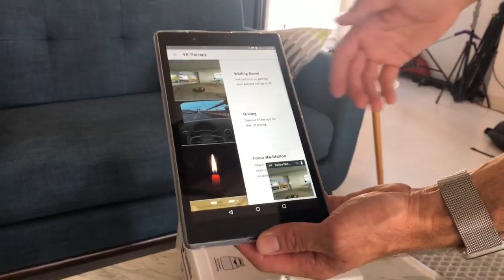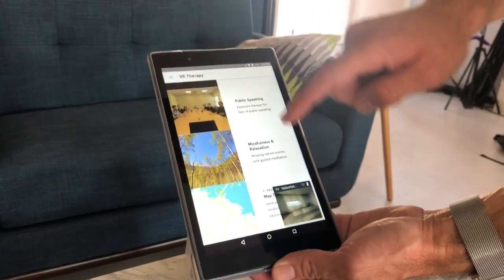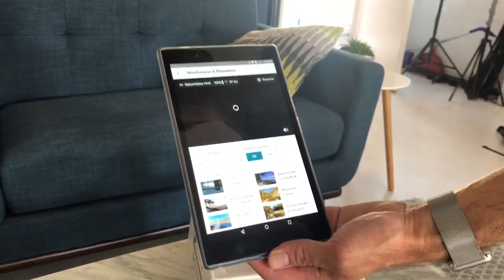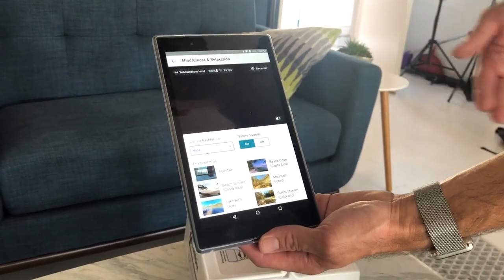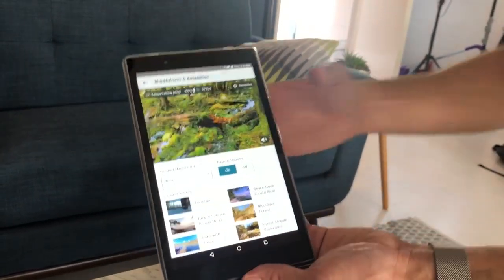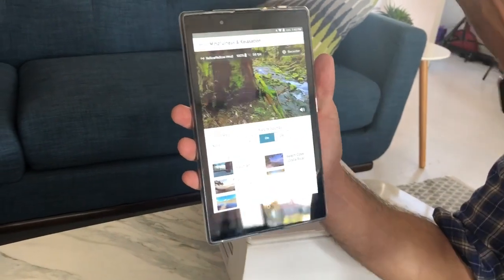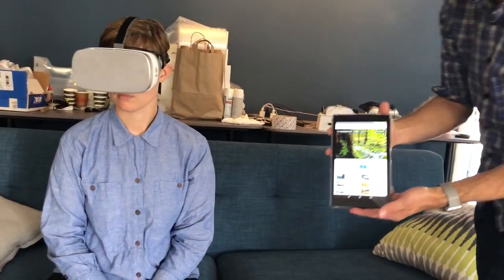So I'm going to start out right now by sending her into a relaxing environment. So I'm selecting the relaxation environment. It's transitioning. And now she is in a relaxing forest setting. I could also turn on some audio guided meditation if I wanted to from this interface. And you'll see as Mila turns her head that the interface on the tablet adjusts accordingly.